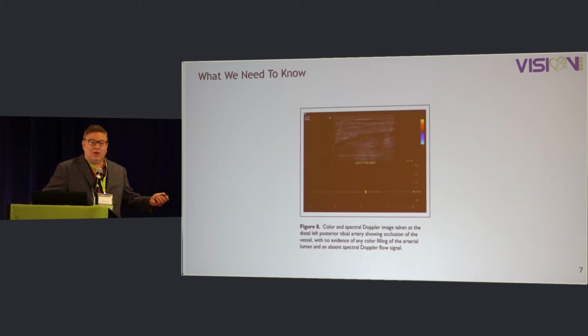So remember, you want to be as close to 0 as you can to enhance flow. So we pick 60 because that we can physically do. We can't really get to 0. And 90 when you want to see the echogenicity of something. So it's almost reversed philosophies between the duplex and the Doppler.